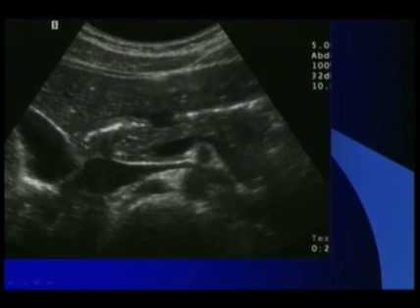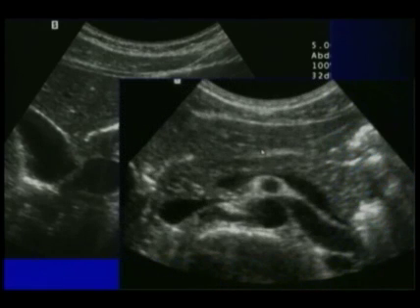You see here a very nice ultrasound image of a normal pancreas. We see here the anterior abdominal wall, a little portion of the left lobe of the liver, and all the way along the anterior surface of the pancreas, you see the stomach, anterior and posterior wall. So in this case, it will be difficult to assess the Wirsung duct in this patient without penetrating the stomach.